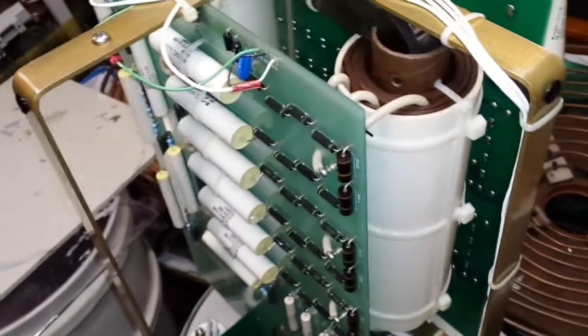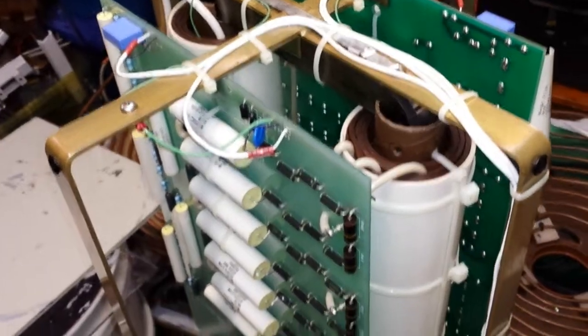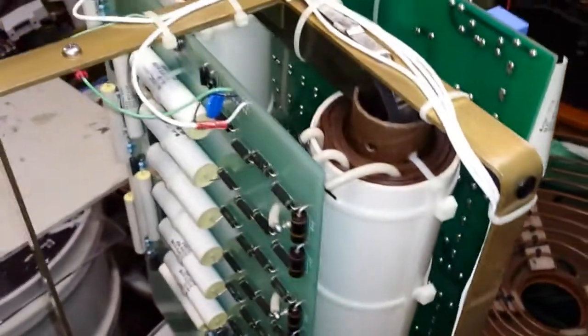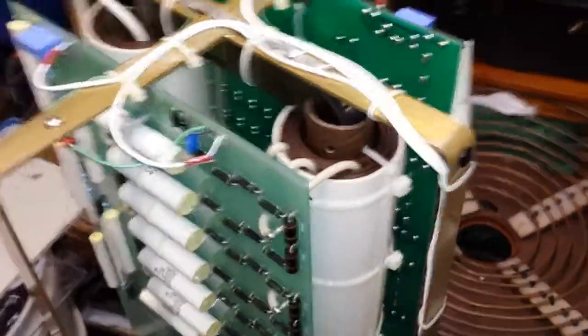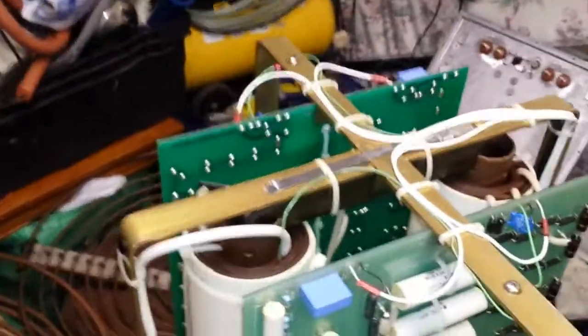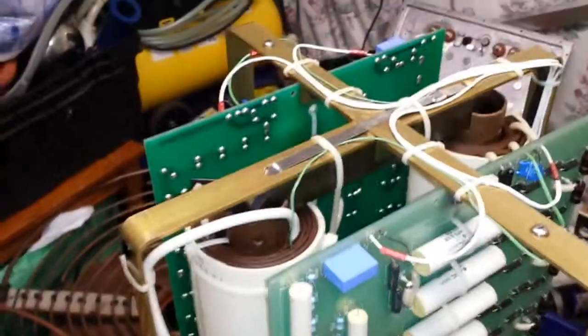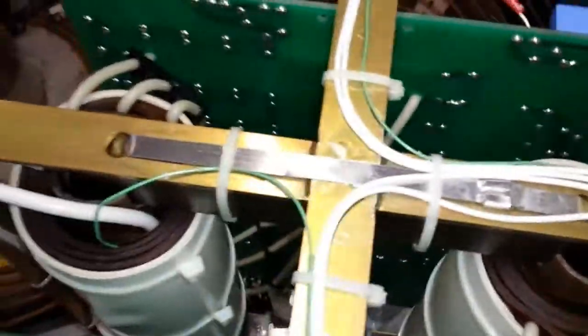I'm not quite sure what type of frequency this will run at. Obviously some high frequency, as the way it's actually wired up with the taps, it's something that I don't think I'll be using. And plus the iron core as it is, I don't know whether or not a friend of mine will be interested in this. It's the particular size and everything. It's not my sort of thing, but it is nice. I do like it, and I might just keep it as it is, so it's just something to look at once it's drained all the oil off it.